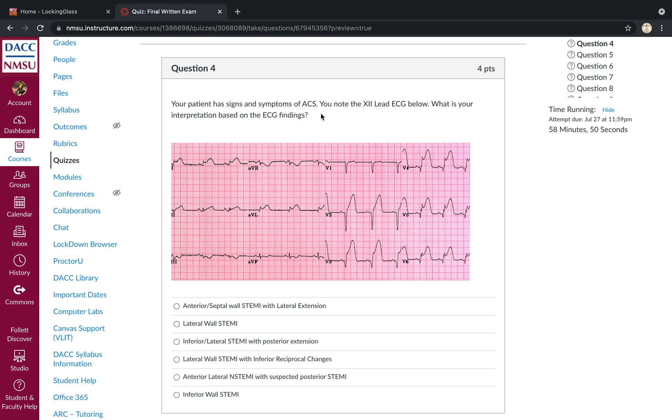Signs and symptoms of acute coronary syndrome. What is your interpretation? So I've got ST elevation in V2, V3, V4, V5, V6, 1, and AVL, reciprocal changes in the inferior leads. So the best answer here would be an anteroseptal STEMI extending into the lateral wall.